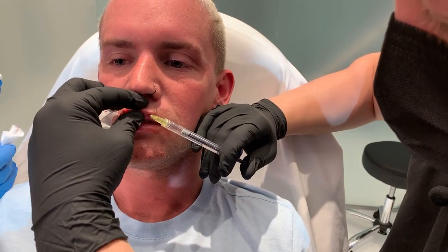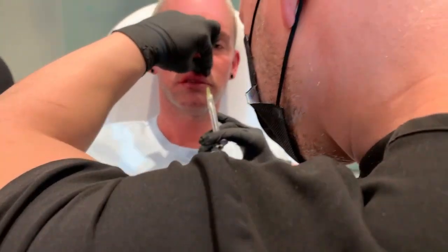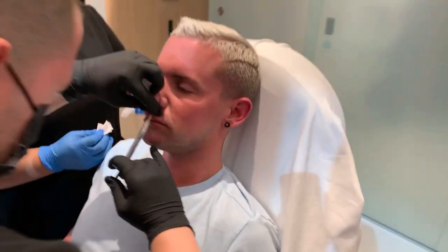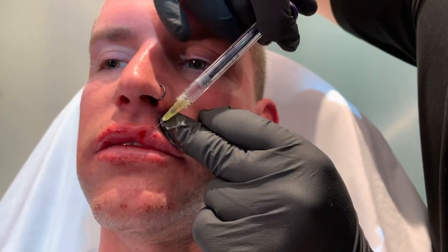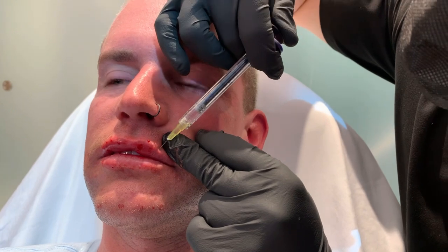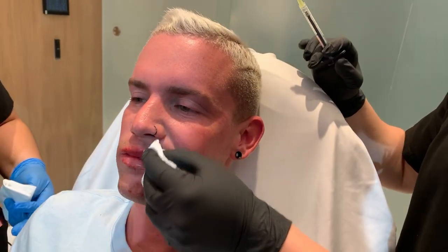We're gonna go right again to the edge of the cupid's bow, right there. I'll come by you really quick. We're gonna grab. And now we're gonna work on lifting. He is numb, yeah, he's numb. So on this side, kind of curls over more. So I'm trying to get it to lift up, doing a pillar technique.